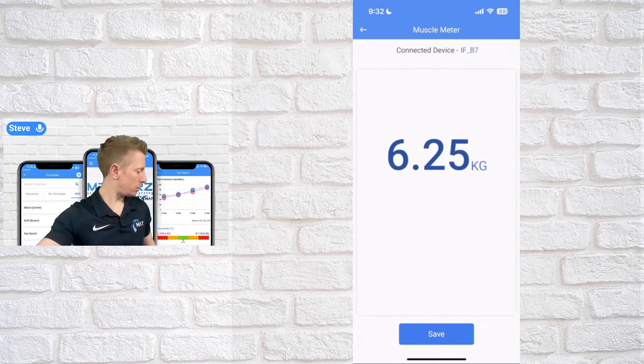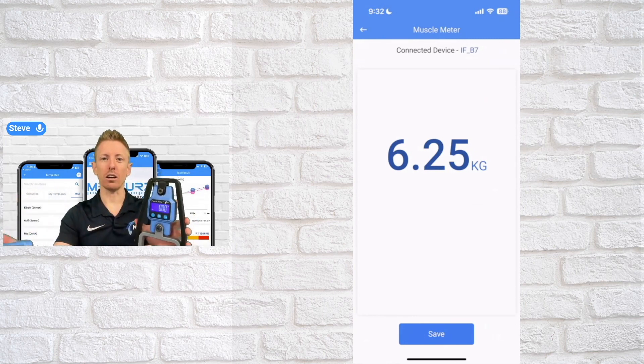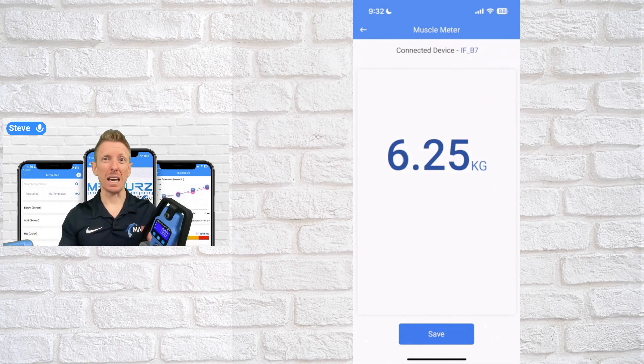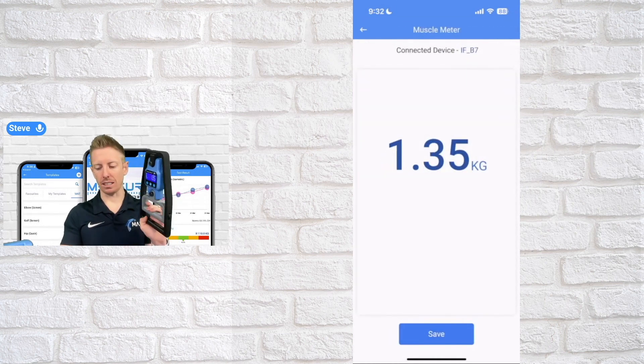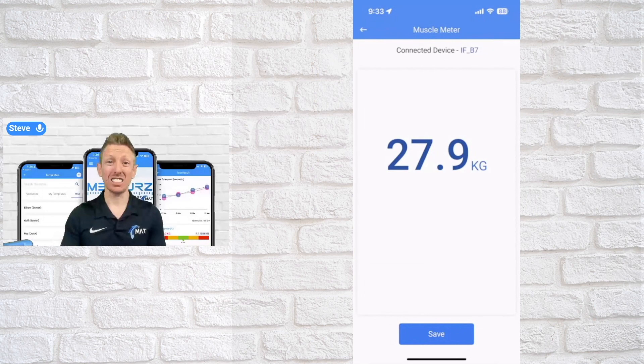If you've got two muscle meters — for instance one set up for grip and one for pushing or pulling — given the affordability of the device it's easy to add an extra muscle meter to your business. To switch between them, go to the device name, click the device list, and simply switch the device. That will switch between the devices and you'll get data for that particular device — a really quick way to switch between devices and get started testing with your muscle meter and the measures app.